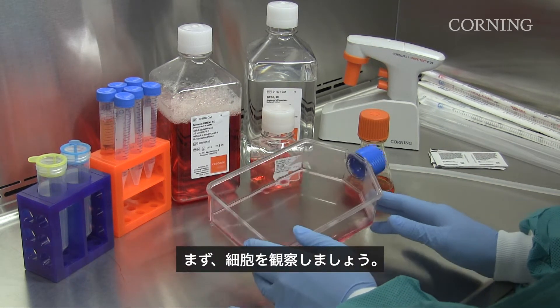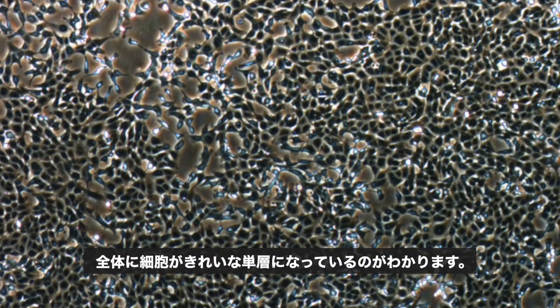First, let's examine the cells. Here we can see the cells appear as a nice monolayer throughout the culture.